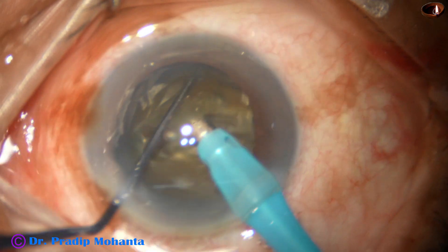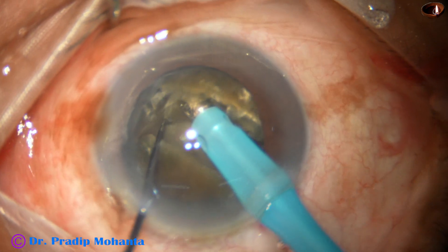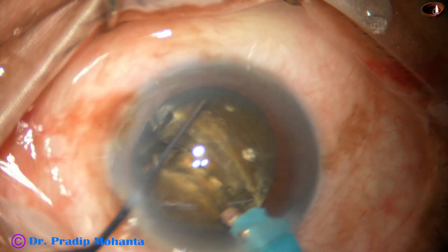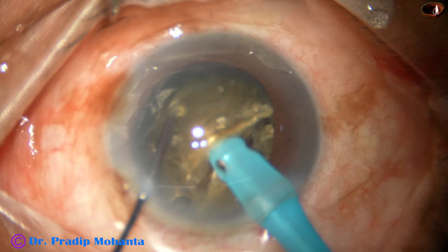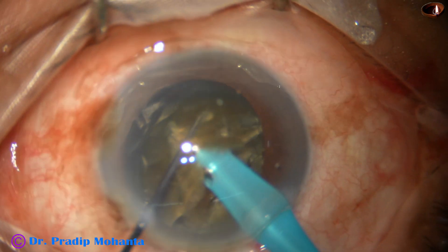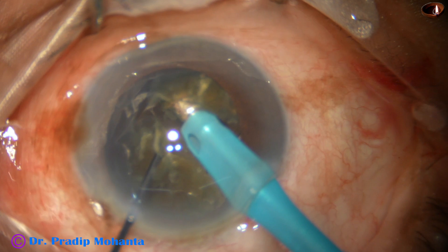I sculpt, rotate 180 degrees, come to the other side, hold the hemi-nucleus with vacuum and separate the other hemi-nucleus using the chopper. Now I am using the same technique — going through the substance of the hemi-nucleus and dividing it into two large pieces.